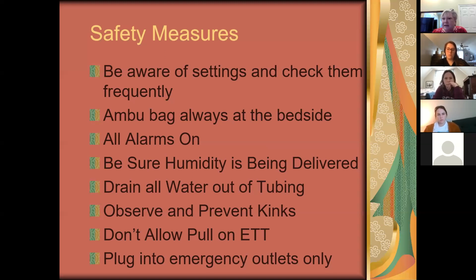Make sure that humidity is being delivered. There should be water or some type of humidity being delivered. I think I talked about this on break. You're bypassing your oral and nasopharynx. That is where humidification takes place. We have to provide that humidification, or their secretions are going to get white, thick, sticky, hard to suction, and they are going to get in trouble. They must have some type of humidity being delivered.